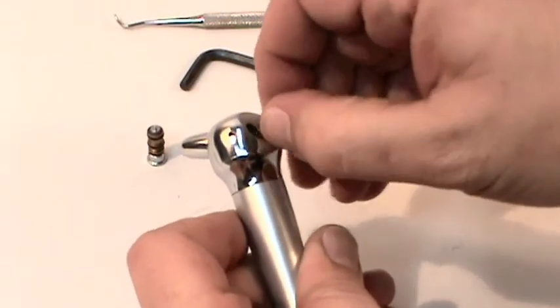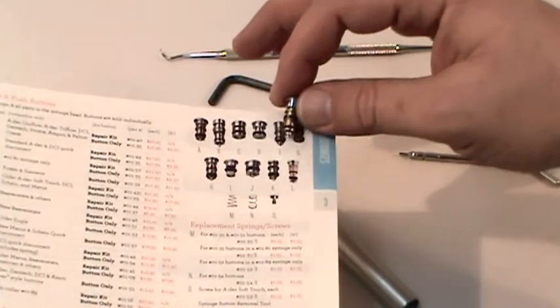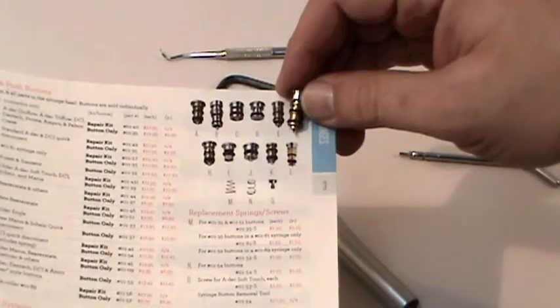Once your buttons are out, grab your American Dental Catalog to find a match for your button. We have the syringe components available separately, or you can get a kit with all the parts you need for a full rebuild.